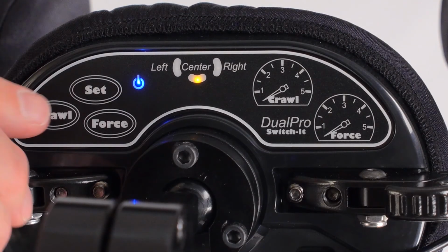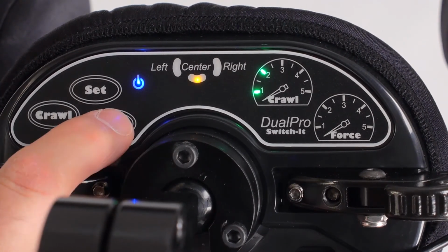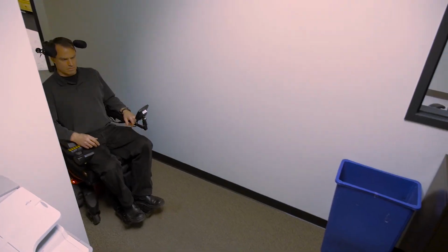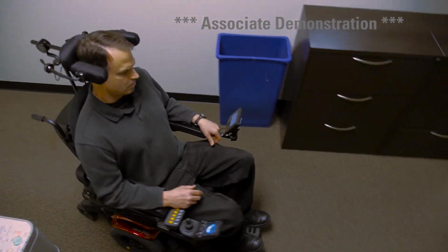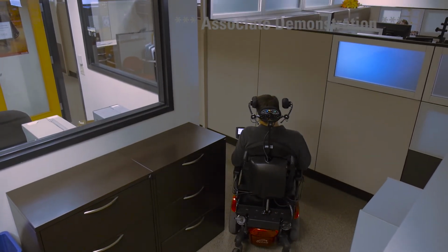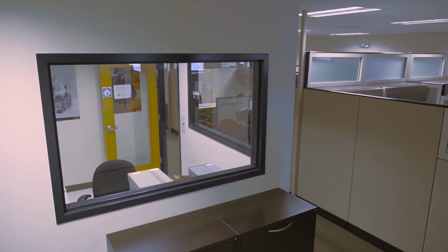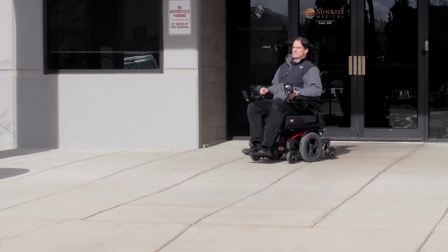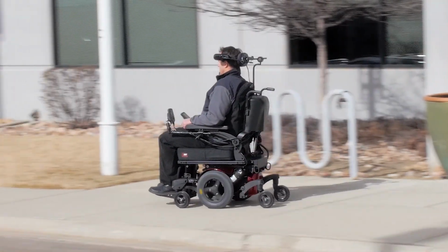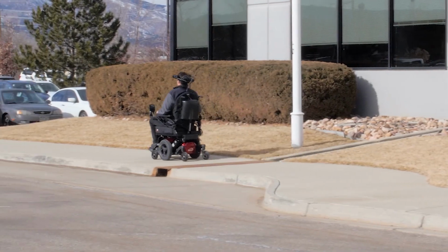Probably the most popular setup is to set the proximity, or crawl, on level 2 and the force on level 3. This provides a nice mix of both proximity and force, so the user can easily move up to a 40% speed in a grocery store, office, or home setting. Once they are in a more open area, they can press into the head pads and achieve 100% speed without having to change profiles or modes.